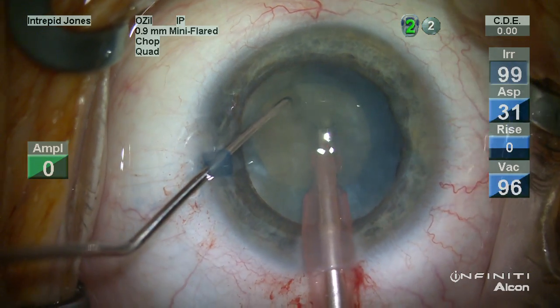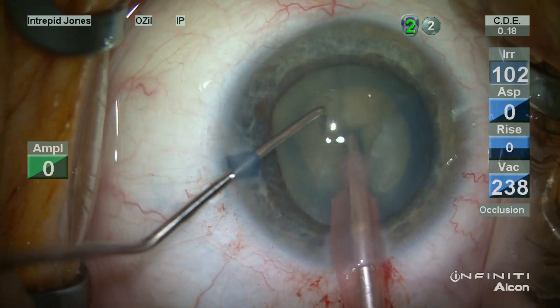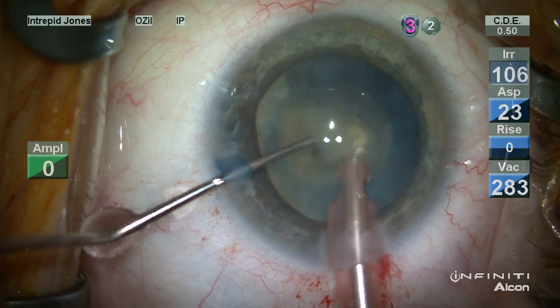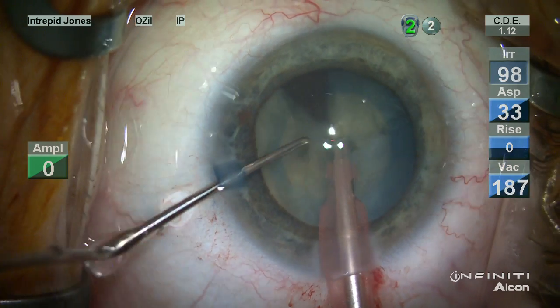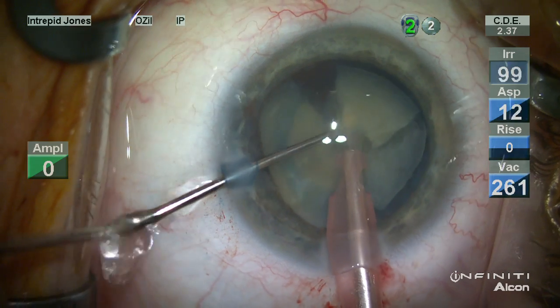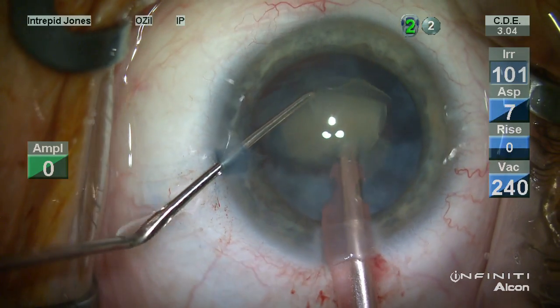This smaller opening permits phacoemulsification of this lens. There are some significant dense regions of the lens and a phaco-chop technique is employed. It is important to keep the capsulorhexis small at the early stage of this surgery in order to maintain control of the opening during its creation. This continuous opening keeps this element of the surgery safe, as it permits some manipulation and stretch during the phacoemulsification portion of the surgery.